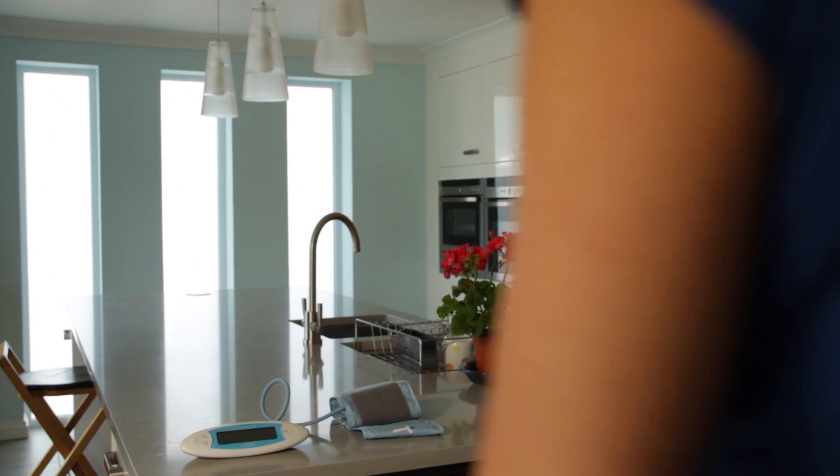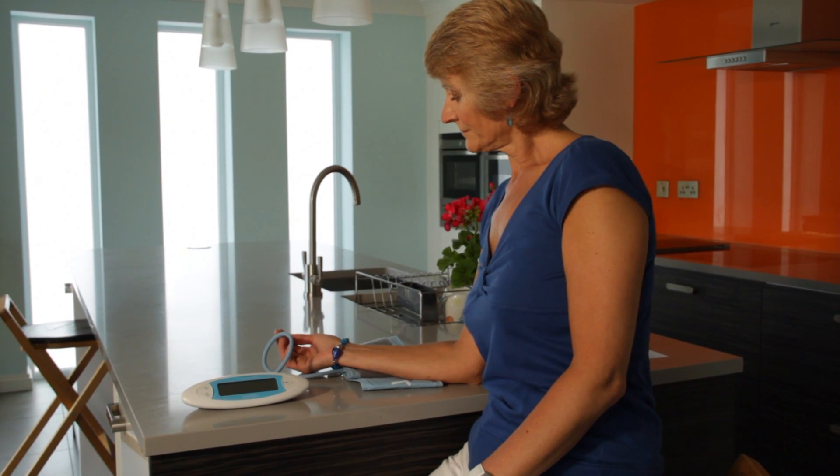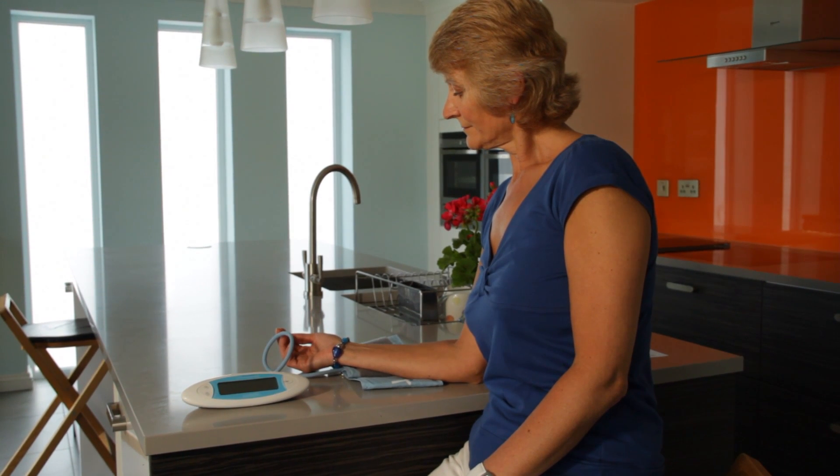You should first make yourself comfortable, sitting upright. Your arm should be supported by a table or desk so that you can apply the correct sized cuff comfortably.